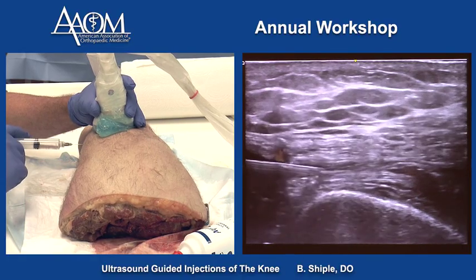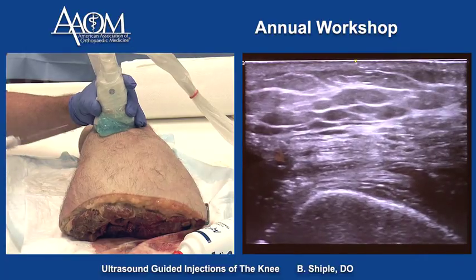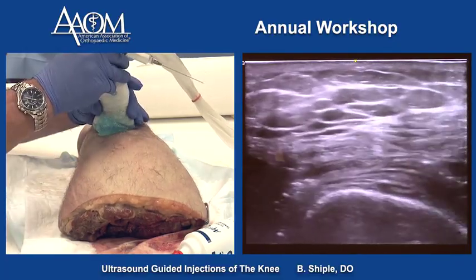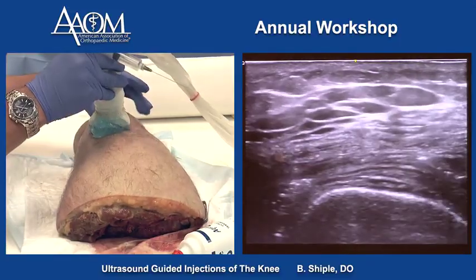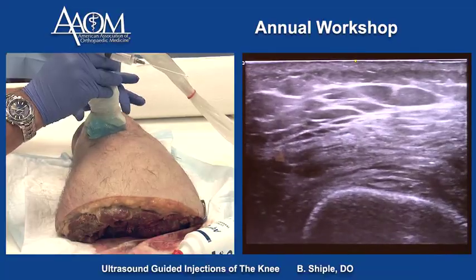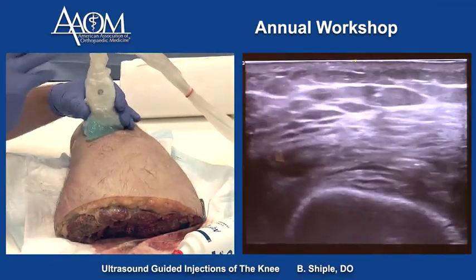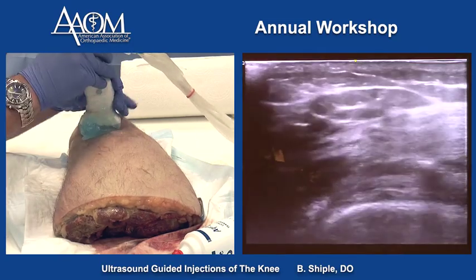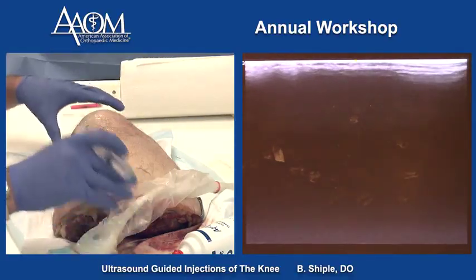I'm injecting and there's no visible expansion of the fat pad or the quadriceps tendon, so I'm in the joint. That is the suprapatellar pouch injection technique to get into the knee joint without putting the hyaline cartilage at risk underneath the patella, unlike the classic Jackson technique or the anterior portals.